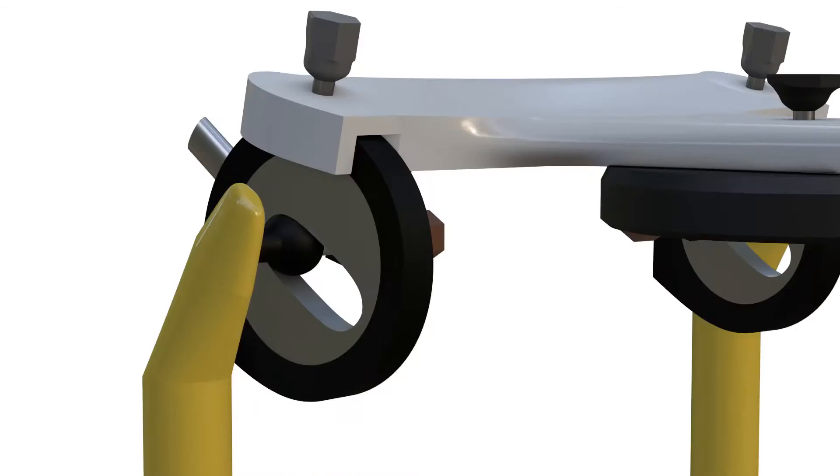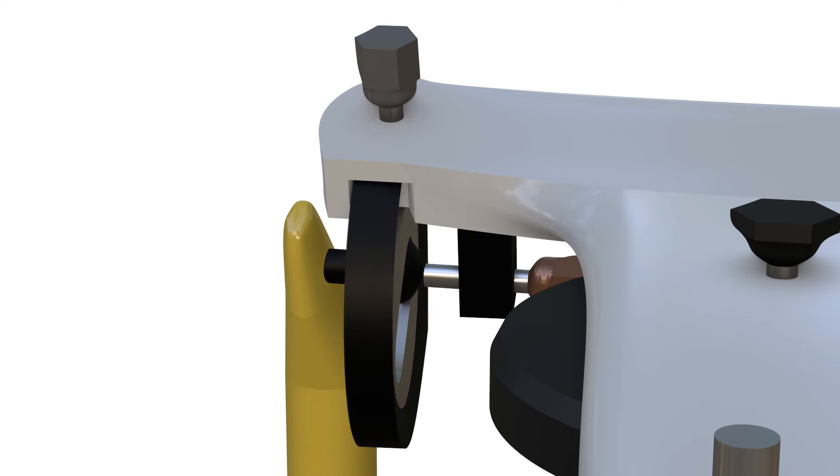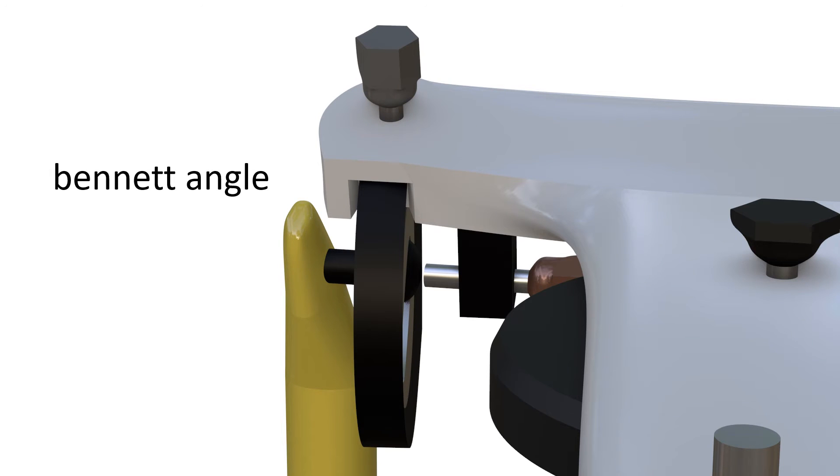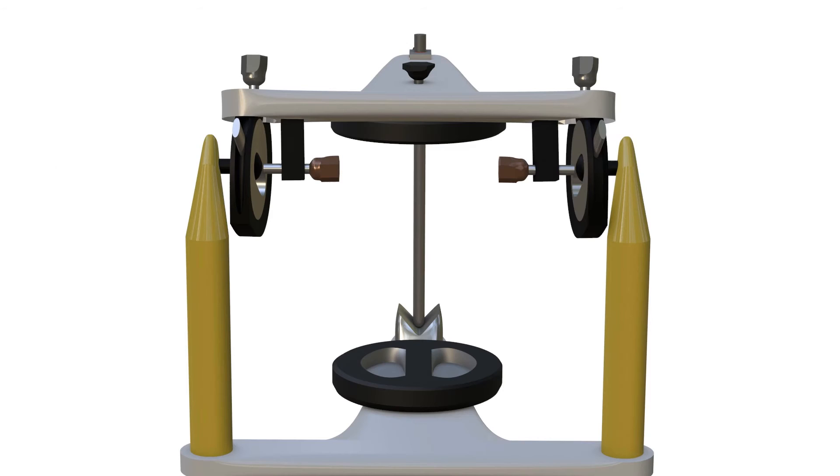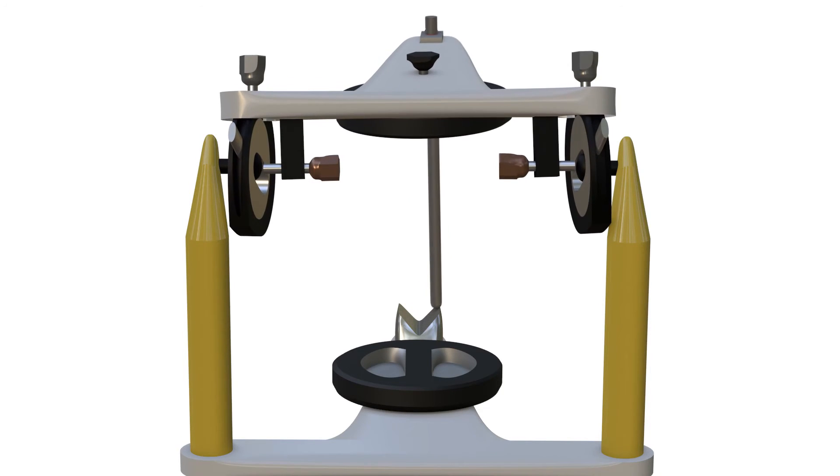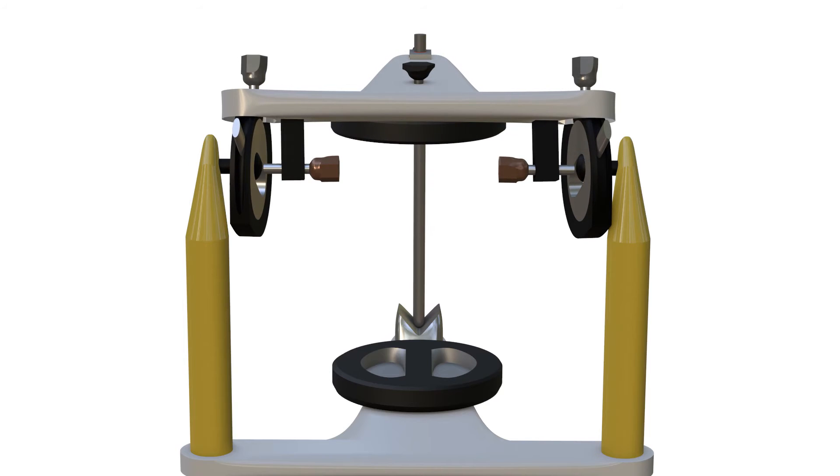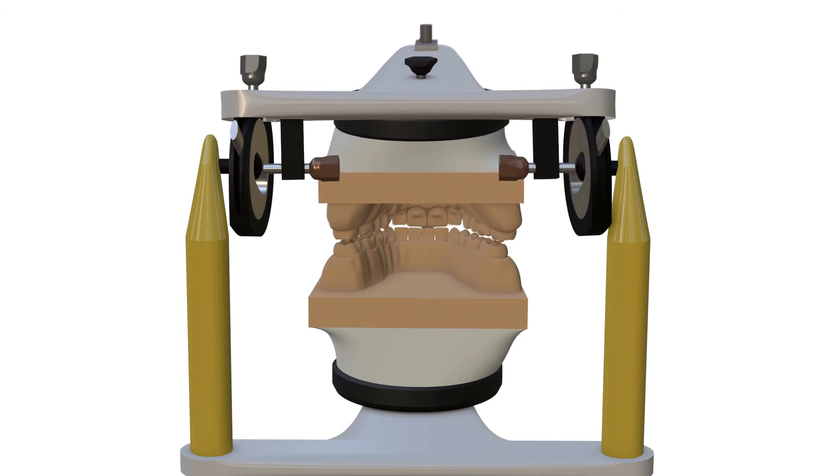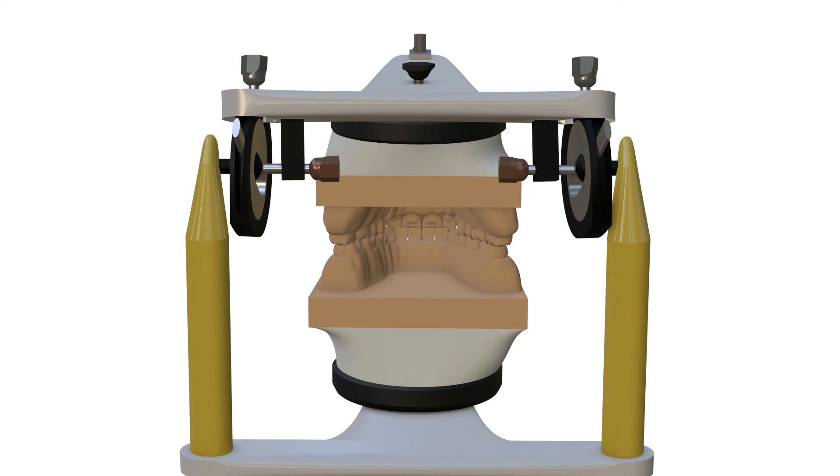From this point of view, it is advised to choose articulators that propose Bennett angle adjustments. The Bennett angle that is adjusted individually or with approximate values provides the dental technician to create an occlusal morphology required for a comfortable occlusion. However, for an effective Bennett angle, it is obligatory for the articulator to make immediate side shift, in other words, the Bennett movement.